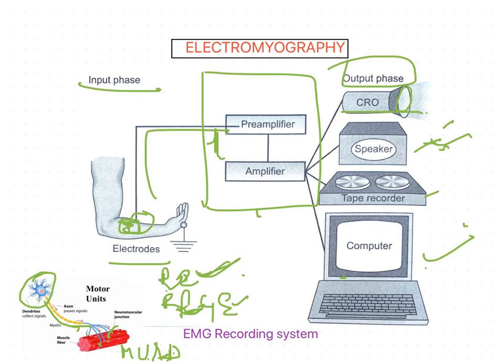That data is used for further studies. So this is about the functioning of electromyography.